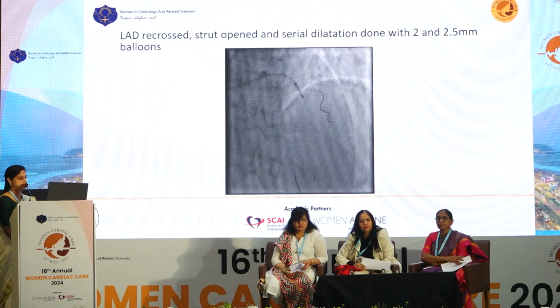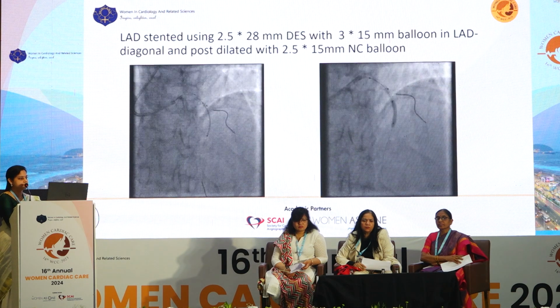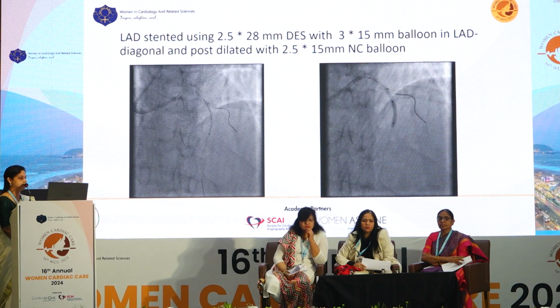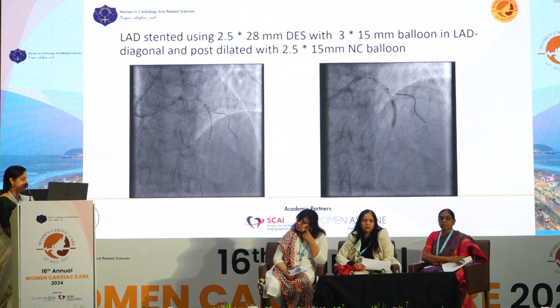Then the LAD was recrossed through a proximal strut. The strut was opened and serial dilatation done with 2 and 2.5 mm balloons. So LAD was stented using a 2.5 into 28 mm DES. Since we stented LAD to diagonal first, we changed the strategy to reverse crush technique.